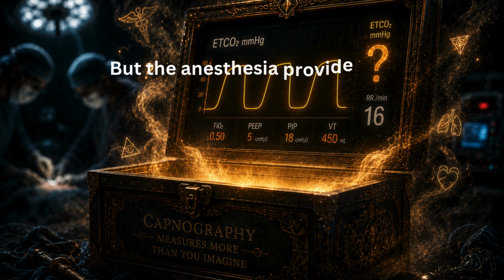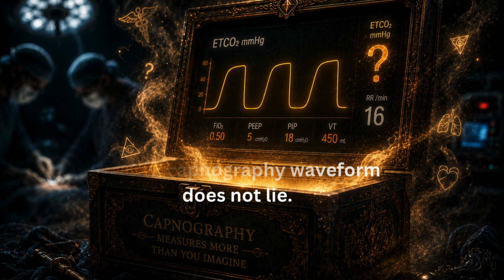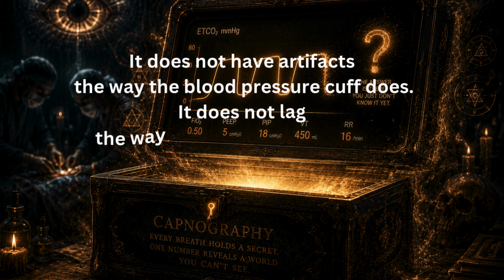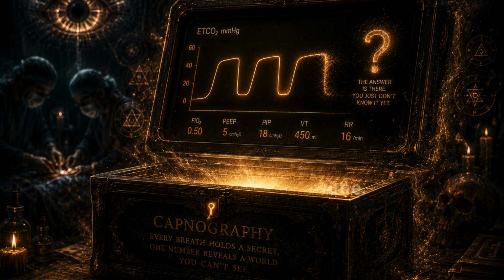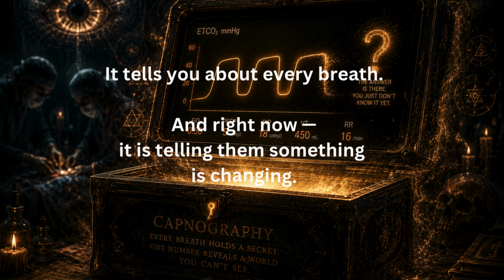But the anesthesia provider is watching, because they know that the capnography waveform does not lie. It does not have artifacts the way the blood pressure cuff does. It does not lag the way the pulse oximeter does. It does not tell you about one moment in time. It tells you about every breath. And right now, it is telling them something is changing.